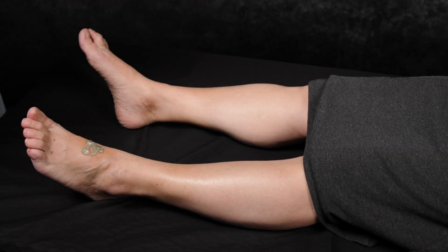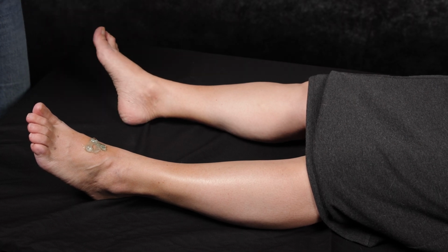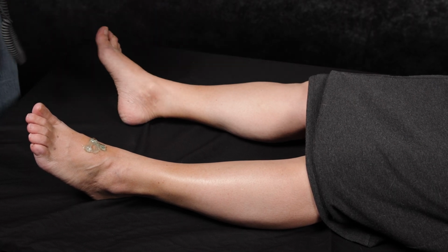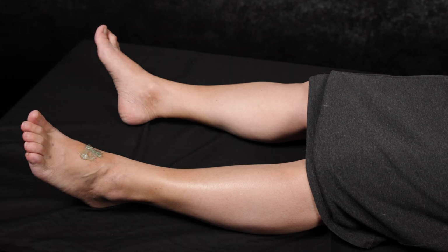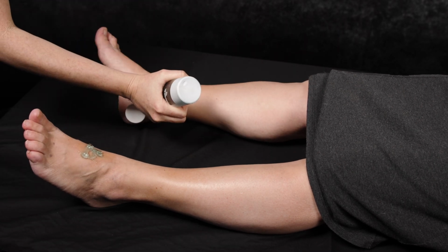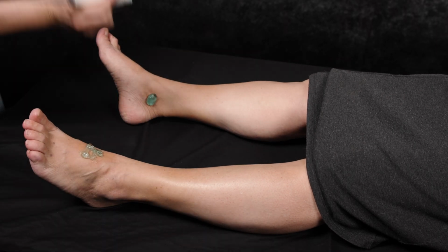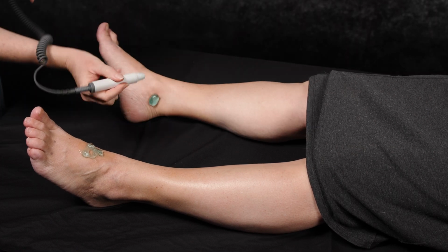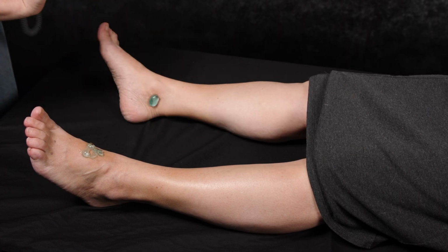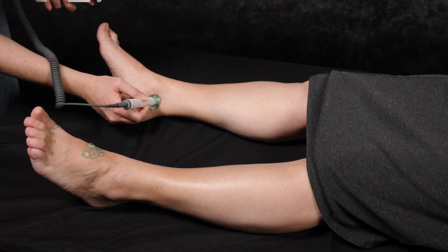The next pulse we will have a look at will be the posterior tibial artery, which is located just behind the medial malleolus. So what I'm going to do is put on my Doppler gel. Again, using lots of Doppler gel and just making sure the foot's nice and relaxed. The patient will inevitably try and pull their foot up to help you, but the foot should be relaxed.